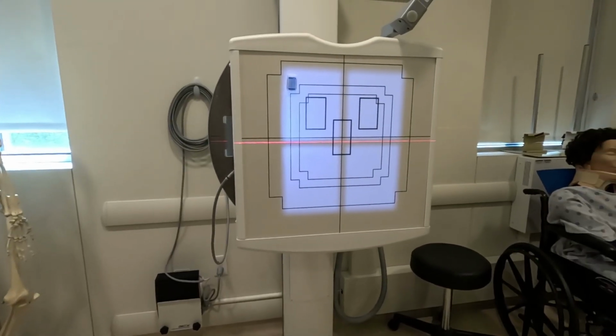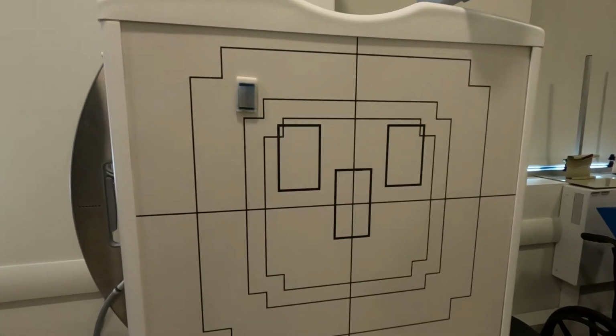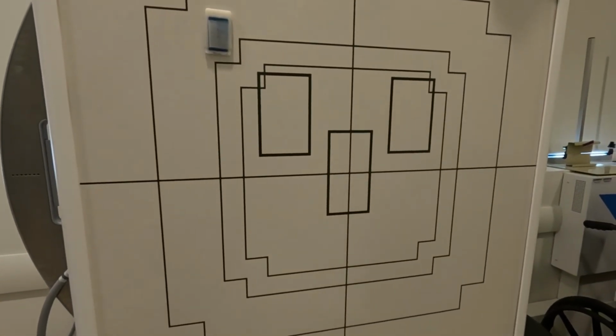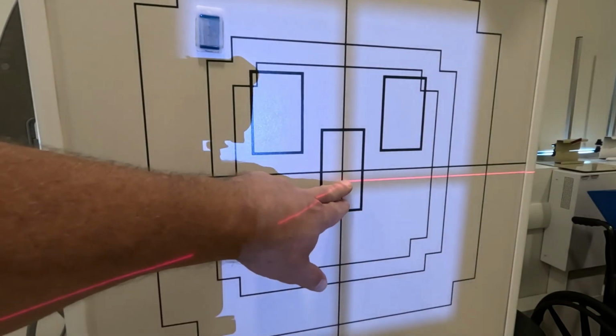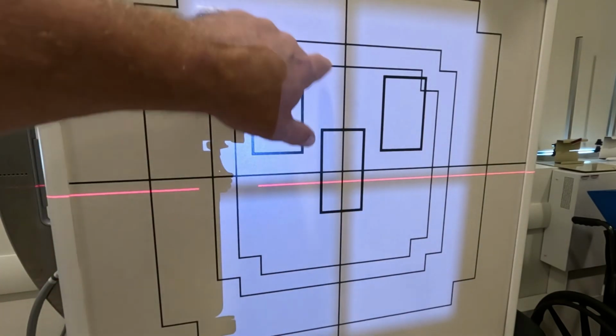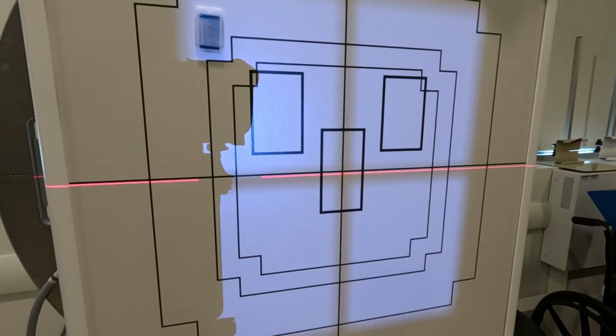So if you notice, you've got one other thing that's a little bit off here. I'll move it a little bit closer so that you can see a little bit better. And that is, we're not completely lined up, right? So our crosshairs are here, and the crosshairs on the wall bucky are up just a little bit. So I need to come up some. So press the blue button, elevate my tube a little bit. Now I'm perfectly lined up.